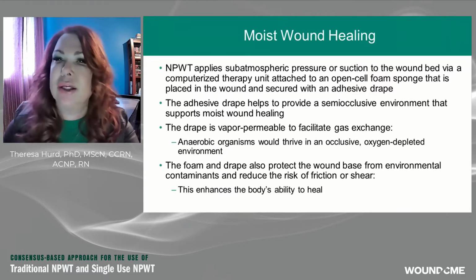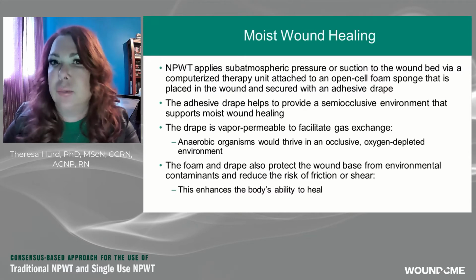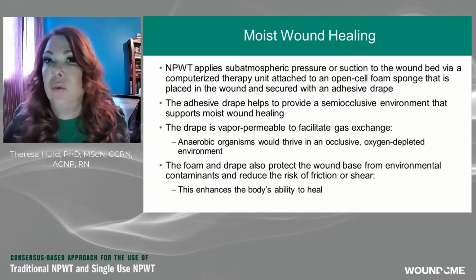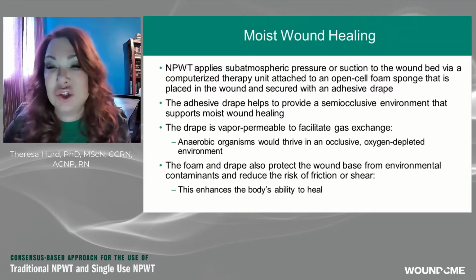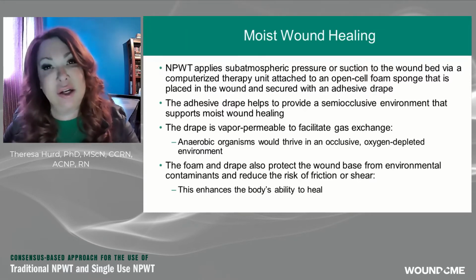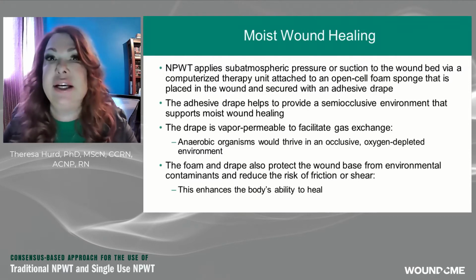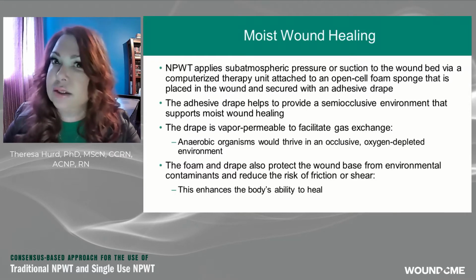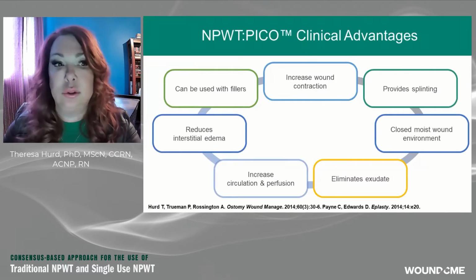Once again, this slide is just demonstrating exactly from a physiological or pathophysiological perspective what negative pressure does for our wound. In other words, what can this treatment do for my wound? And what we do know is it does enhance healing, thereby decreasing your healing times. Whenever I decrease my healing times, I decrease the financial impact and I decrease the clinical impact on the patient themselves and all of the risks of walking around with an open wound.